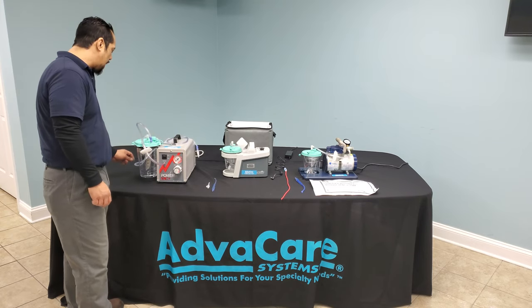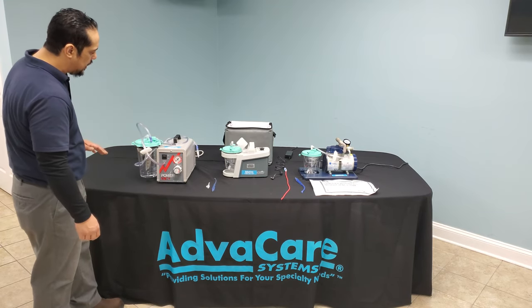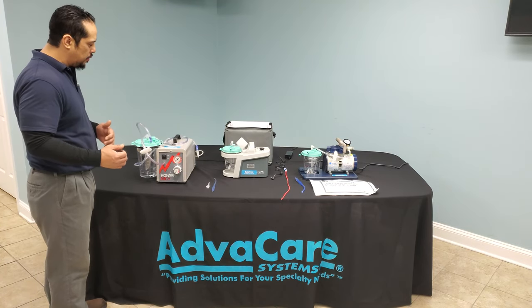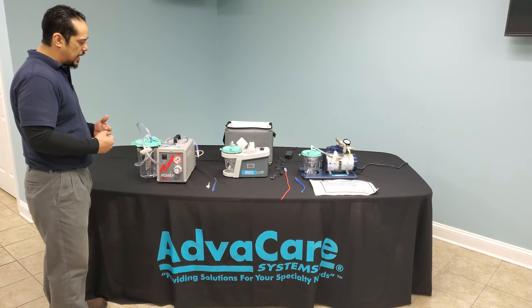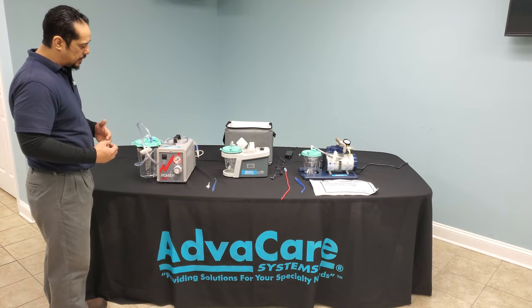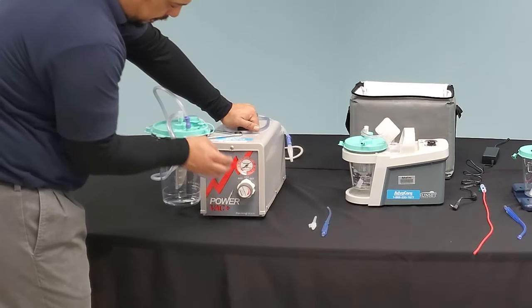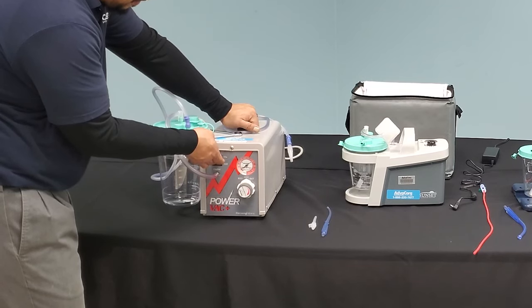It will pressurize, moving fluid through the tubing and collecting it, then depressurize, allowing the small and large intestine a break from the pressure — helping to move and collect waste as it is being produced. The on/off button is located just above the outlet.